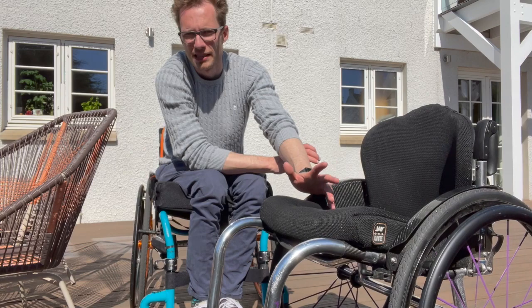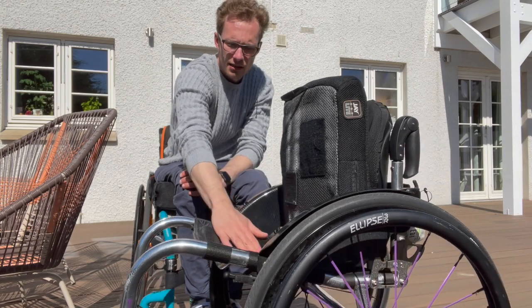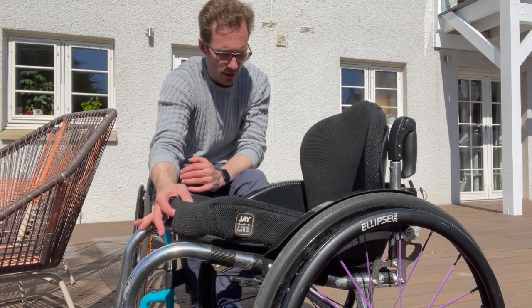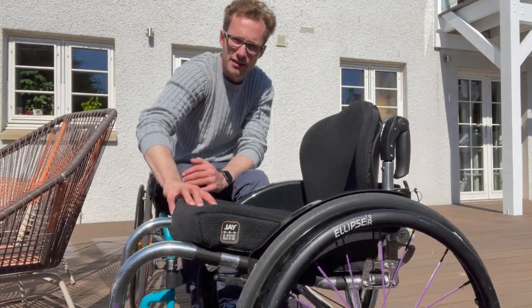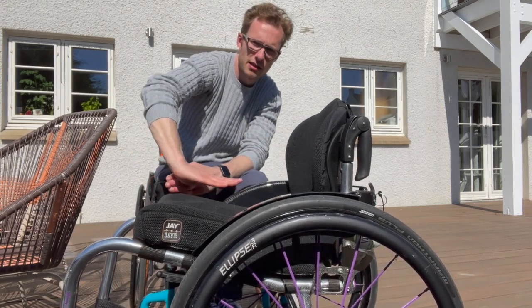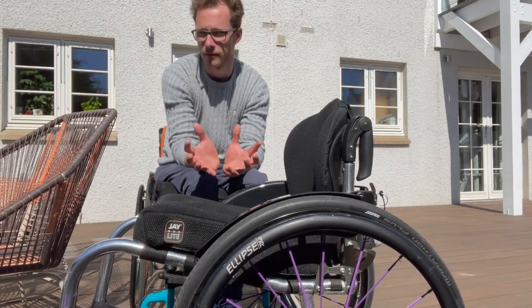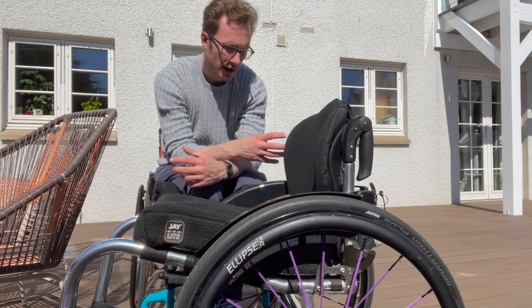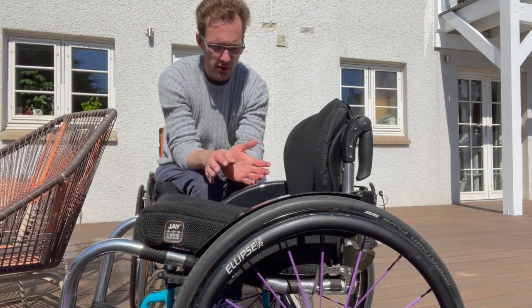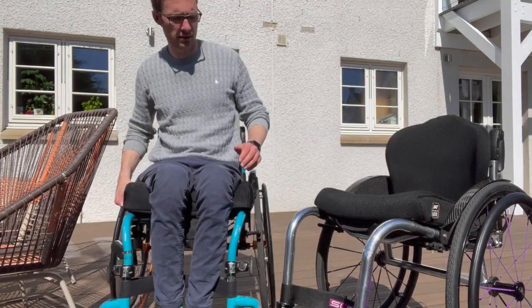I'll skip over the cushion because it didn't come from RGK and everyone's cushion will be different, though they do offer cushions. The underside has tension-adjustable straps which I haven't had to adjust so far but imagine I will over time. The seat is a kind of ergonomic tapered design — there's a backward-slanting section that then goes flat, which kind of hugs you and that ergonomic design is supposed to be more comfortable and secure. That's part of why these chairs are made to measure.